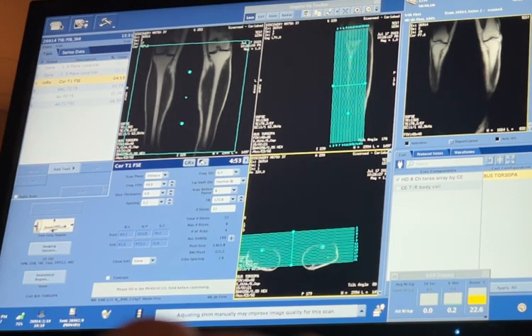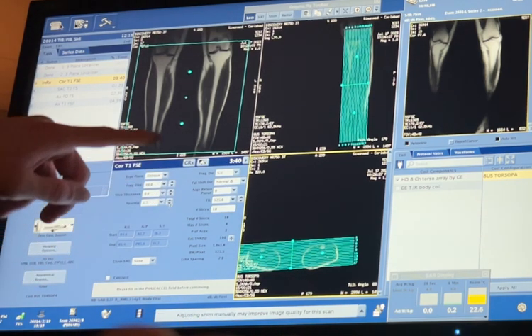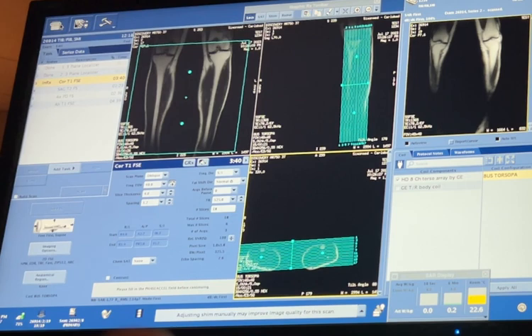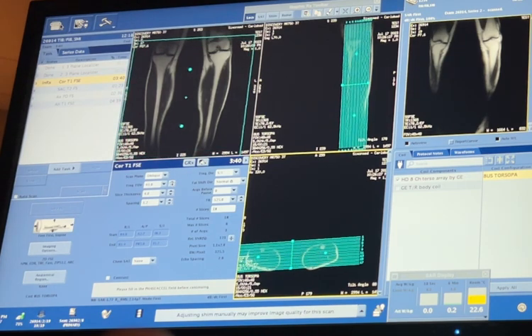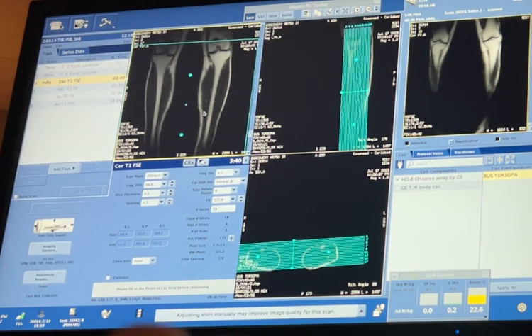There you go. Do I add slices or no? And then you can probably, yeah, let's add one to the back if you look at your sagittal. There you go, perfect. And then do I take some away? Yeah, let's cut some from the front. One more. Right there. Let's do that. Okay. I'm gonna have you increase your FOV because we don't even have the whole thing. I'm gonna have you increase it 2 more times. There you go, and move it down a little bit. There you go, right there, perfect.